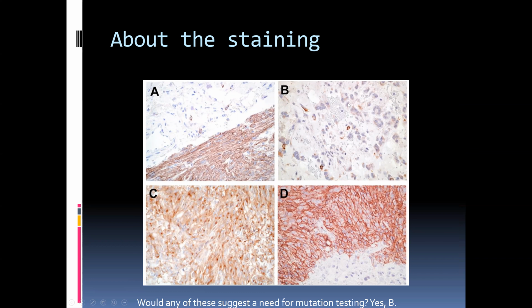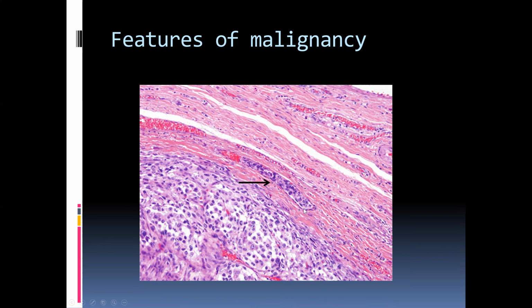These are all consonant with positive stains. What you see here, though, in this more anaplastic variant with just a few positive cells, this should probably be called negative because you're probably either seeing here just sporadic peroxidase activity or some other activity. And so this is the lesion where negative staining might lead to testing for which specific mutation was involved. These lesions can also have lymphovascular space invasion, so it is important to be aware of that and to evaluate, particularly in the more epithelioid lesions, they can have that appearance.